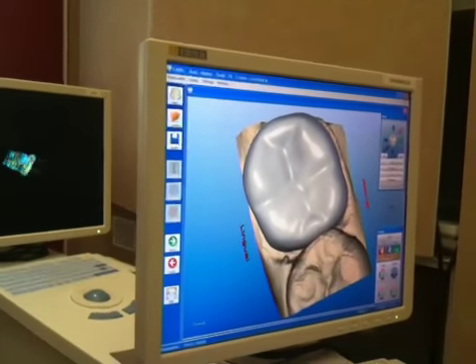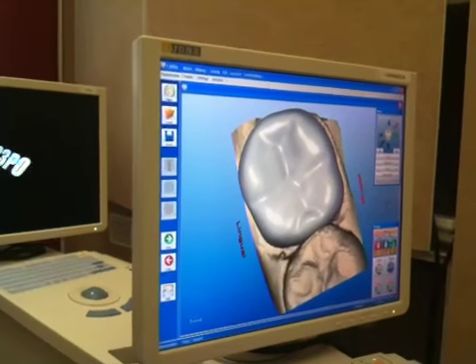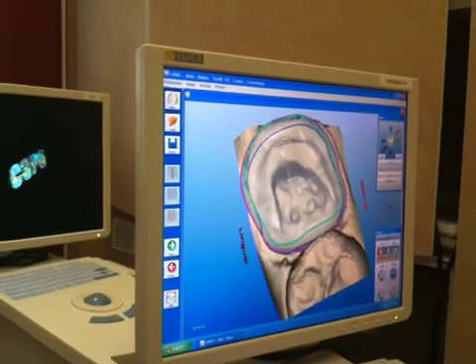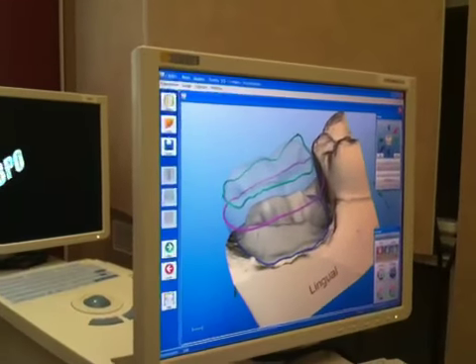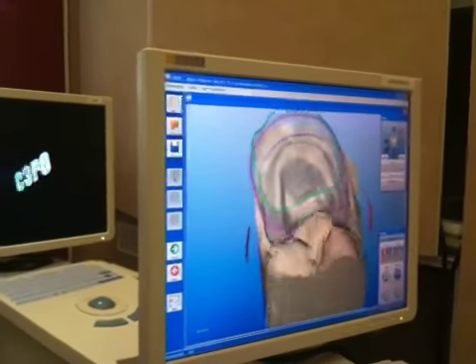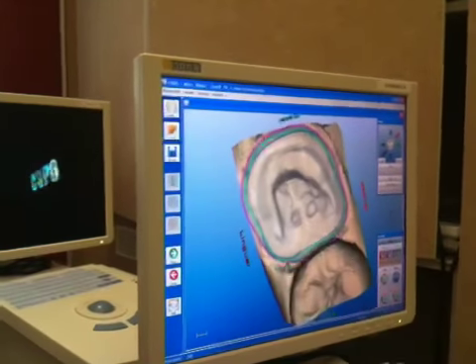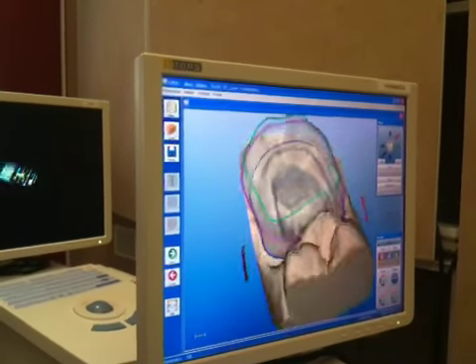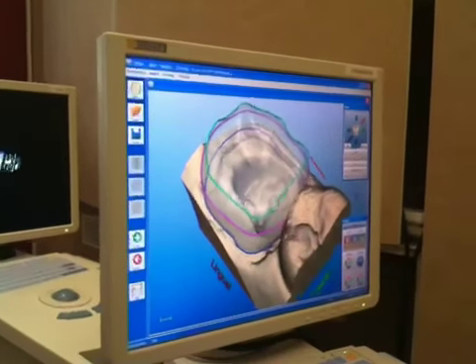Can you show the underside of the tooth? I can. Let's actually go to edit property, and this makes my tooth see-through. Uh-huh. And so here you can actually see how much porcelain I'm adding in this tooth, which is quite a bit. We did a root canal in this tooth. Mm-hmm. So you can see we're missing quite a bit of the tooth structure. That's not always what we do or how much we take away. That's determined by what's happening with the tooth.